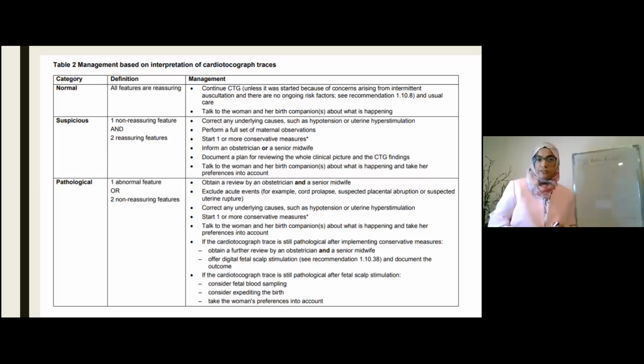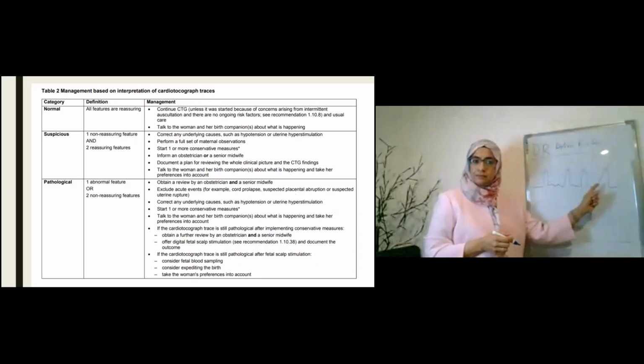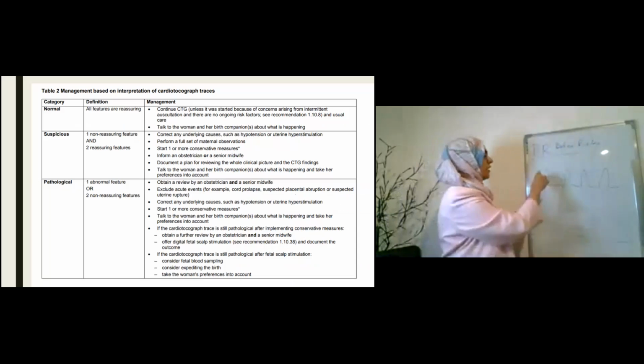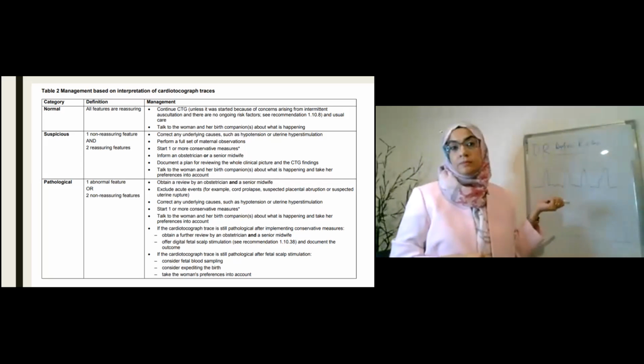What do you think? That's a very good question. I'll try to break it down and answer it, and please tell me if I've covered all the things that you're asking. So first of all, the sensitivity and the specificity of a normal CTG is close to 100. Okay. So if you are getting this CTG, this baby is fine. Until and unless what I've just mentioned to you, as you also mentioned, the operator problem. This was a dead baby, and we were picking up the maternal pulse, and it's such a sensitive CTG that even a little bit of respiratory changes in the mother's pulse, it is picking up and giving us a beautiful trace all night long when we were monitoring a dead baby.